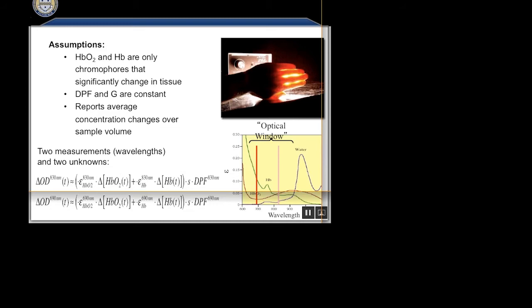Right? At worst you get oxy-deoxy relatively right, that is oxy is 3 times bigger than deoxy, you don't have crosstalk, but at worst you're off by an overall scalar factor of the entire system.